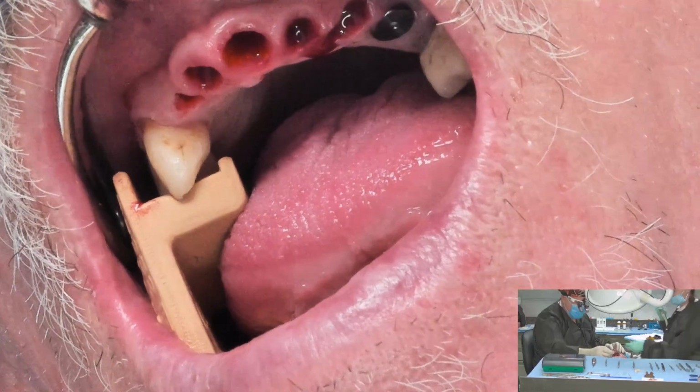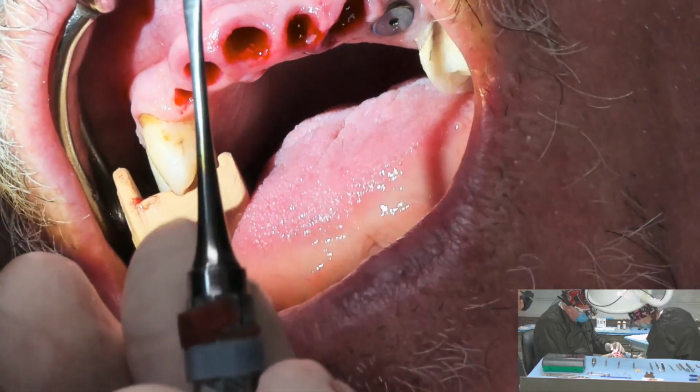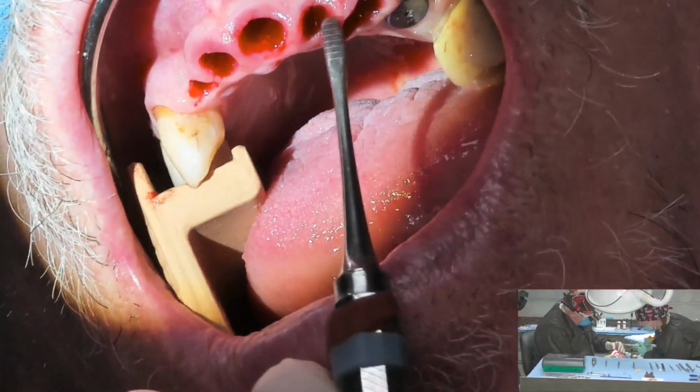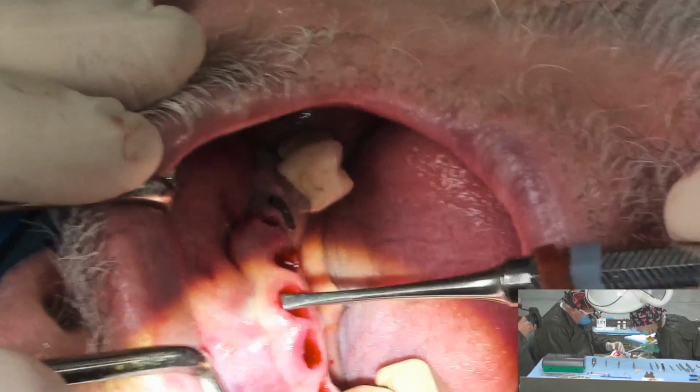You know, let me have my small elevator. Now, also, I had designed these several years back. These are called the Petro 1 and 2 elevators. There's a small and larger one. And what I did these for is not only to help deliver the graft on the facial of an implant, but also to come in from an evaluation of the buccal plate.